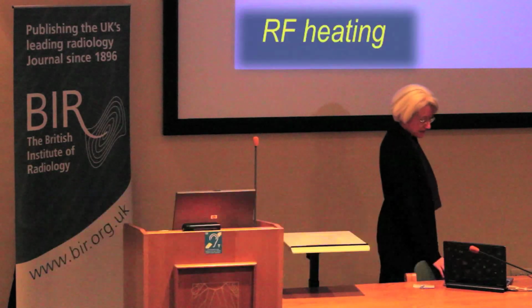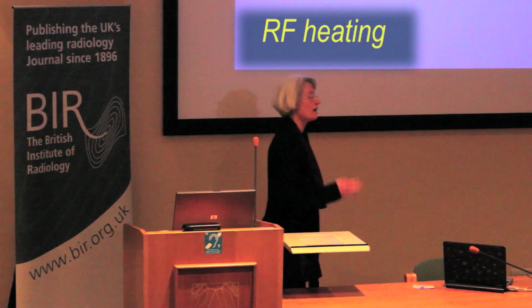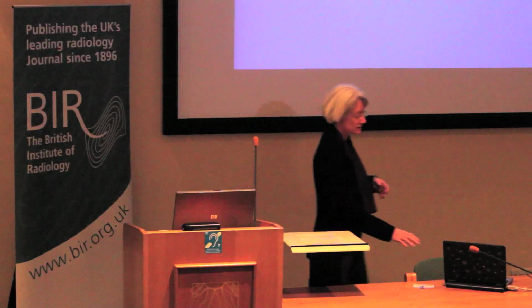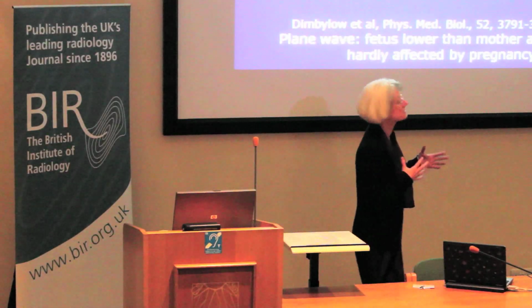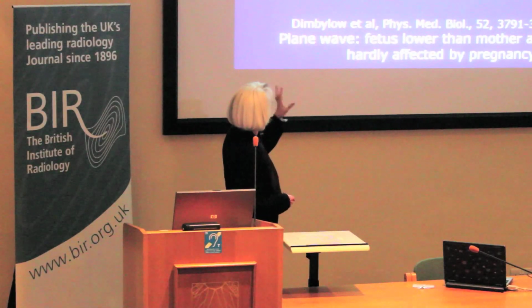Now we go on to RF heating. So first of all, we need to look at how the RF is deposited in the fetus. There's been quite a lot of work looking at RF models of the fetus. So the question is, when you put a person in an MR scanner, how does the RF distribute within the mother and the fetus?